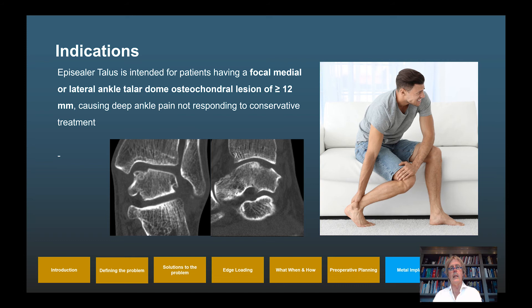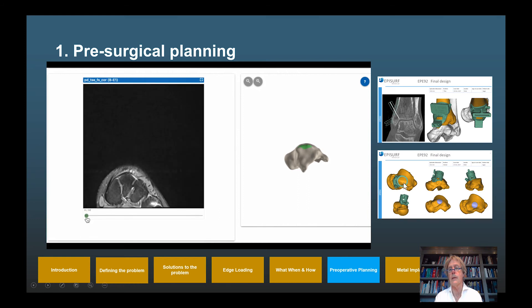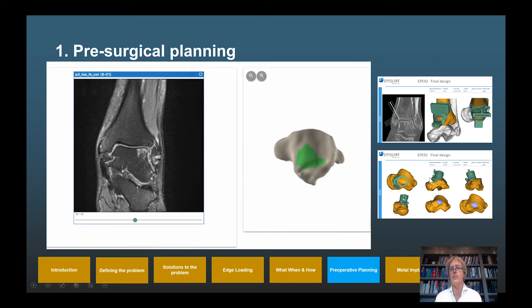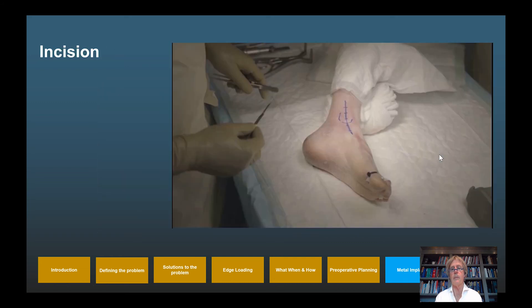The indication is a focal medial or lateral talar dome lesion of 12 mm or larger that is symptomatic. Pre-operative planning is based on CT or MRI, from which the osteotomy guide and implant location are determined exactly, and the guiding instrument is made patient-specific. The instruments include the specific EpiSealer, the specific guide, and the specific osteotomy guide. We will now demonstrate placement of an EpiSealer talus in a left ankle with the patient supine in a bloodless field.